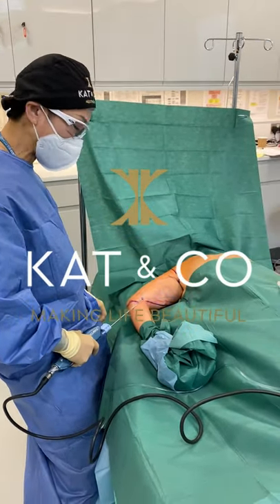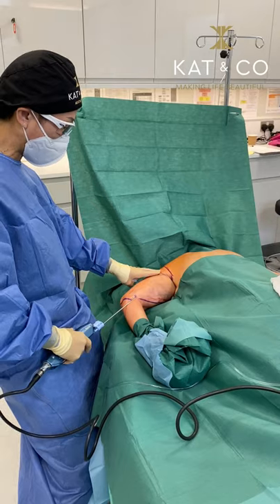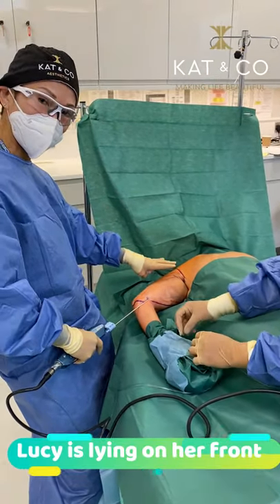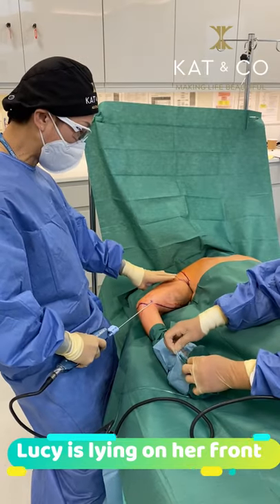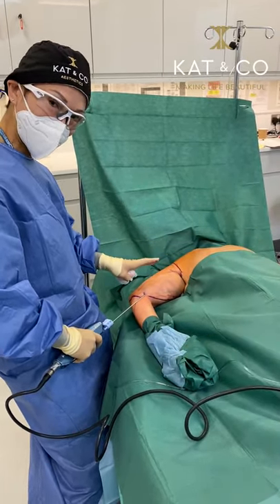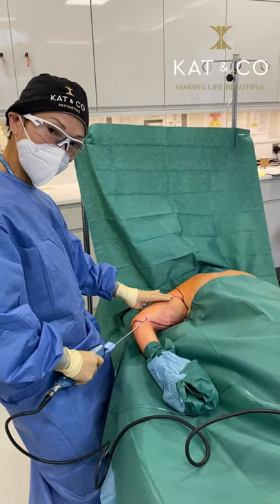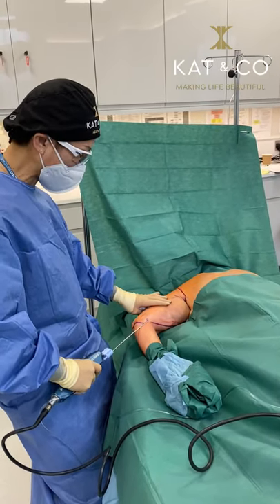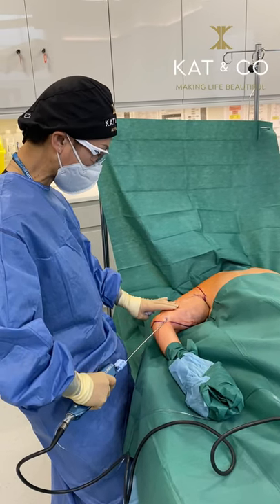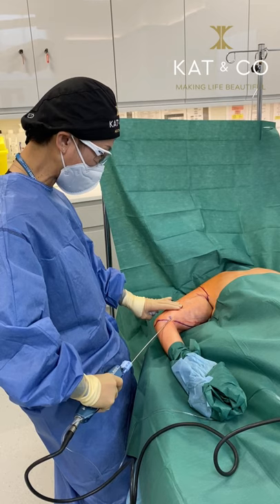Lucy is just having some vaser liposuction to her upper arm where she's got this typical problem of a little bit of localized fatty collection, some loose skin. The vaser just helps remove that little bit of fat and tightens the skin at the same time. She's having it done under local anesthetic and this is the local anesthetic going in. Obviously it will sting but she's reasonably comfortable.